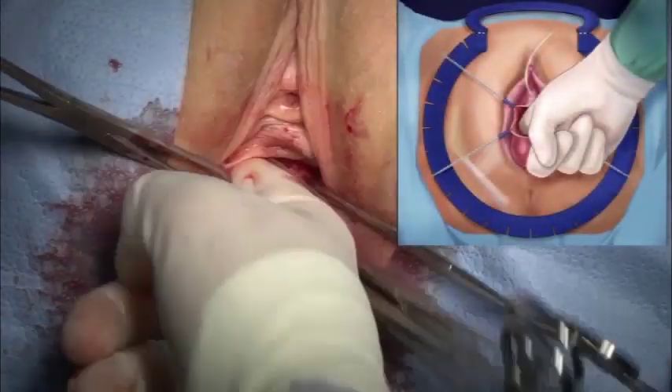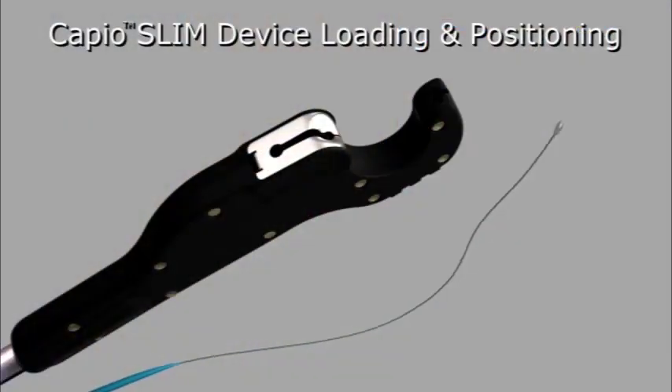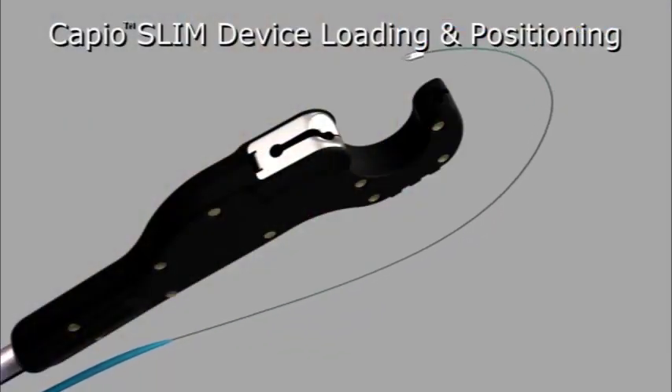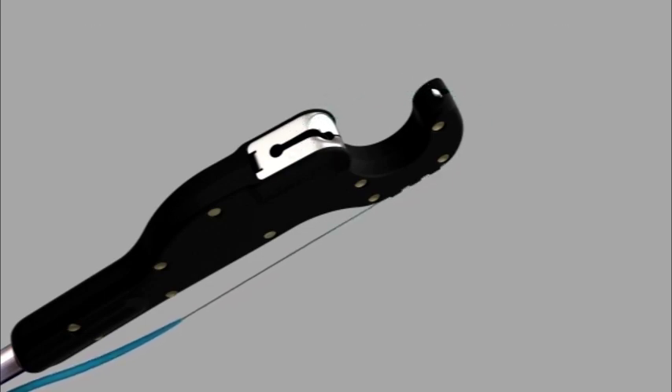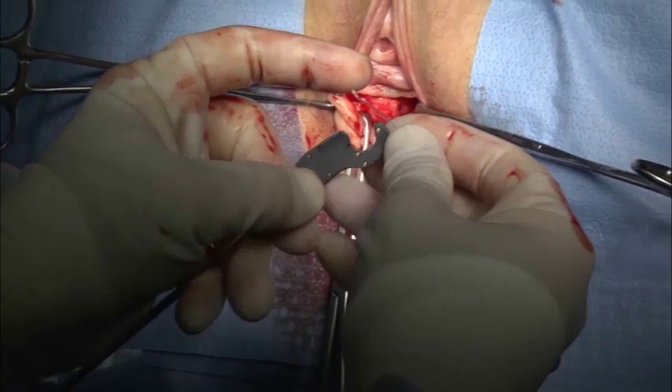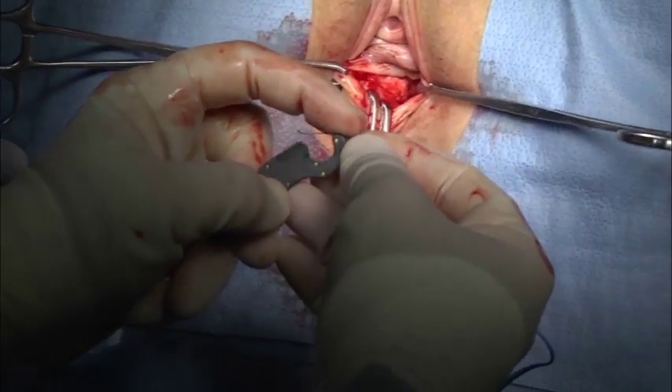Contralateral dissection is completed. Engage the dart into the carrier by gently pulling down on the lead. Ensure that the tip of the dart is completely pulled into the carrier by slightly depressing the CapioSlim device driver button.